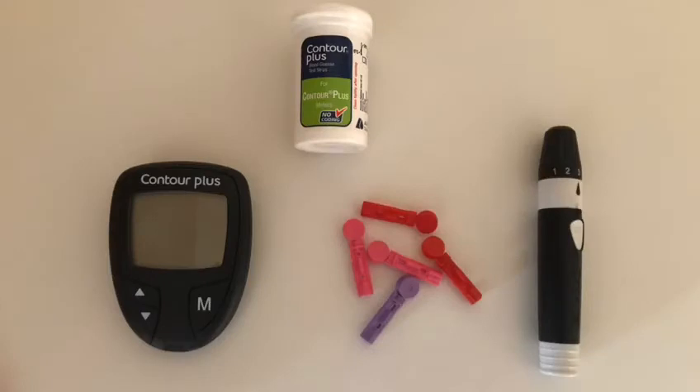You will need the Contour Plus blood glucose meter, a pot of Contour Plus testing strips, microlet lancets and the finger pricking device. The testing strips and the lancets will be prescribed by your GP.